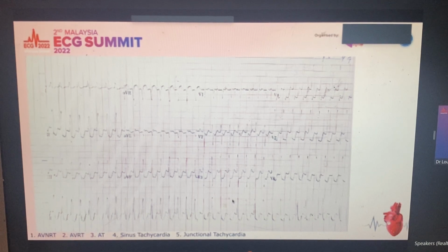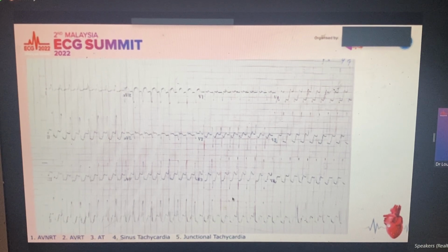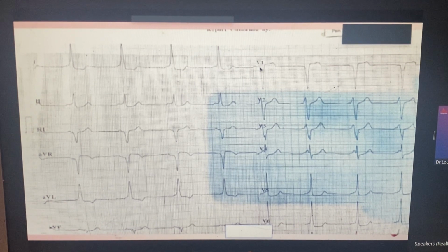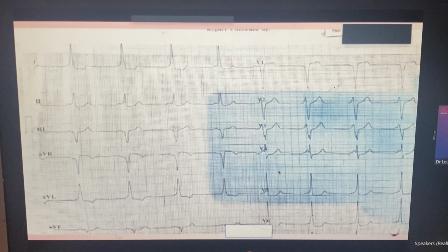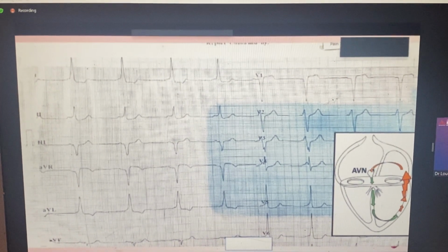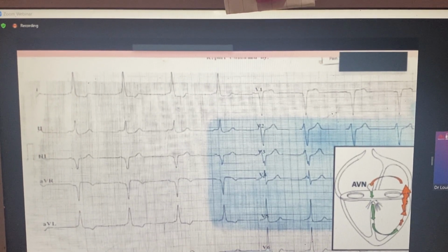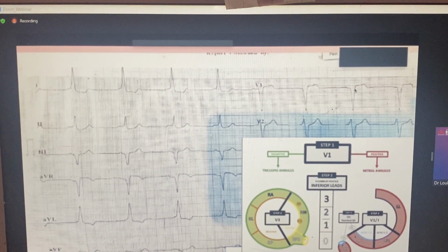And this patient came in unstable, so she was cardioverted. When the patient is cardioverted, it makes things really easy, because when you look at the sinus ECG for this patient, you can clearly see an initial slurring of the QRS. This initial slurring is termed a delta wave, and this patient actually has Wolff-Parkinson-White syndrome, which makes the previous ECG an orthodromic tachycardia because it's narrow complex. That involves the tachycardia using the AV node as the antegrade pathway and the accessory pathway as the retrograde pathway.